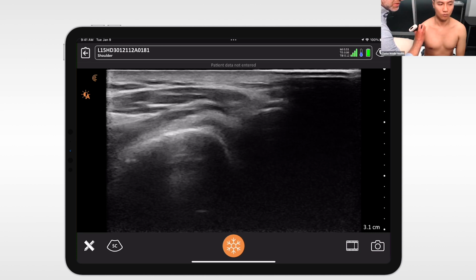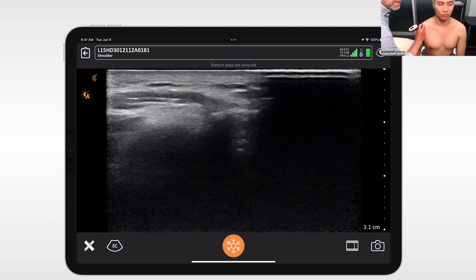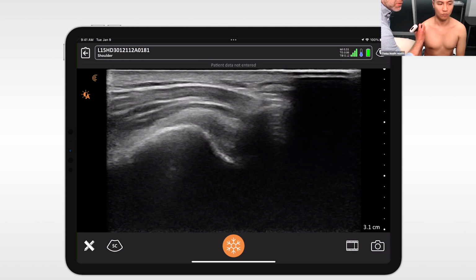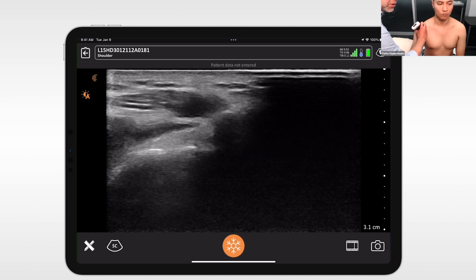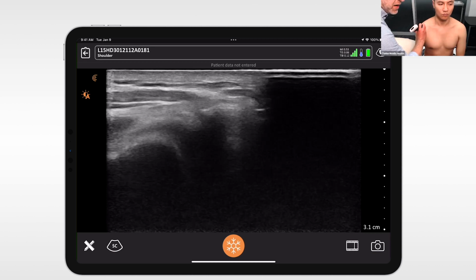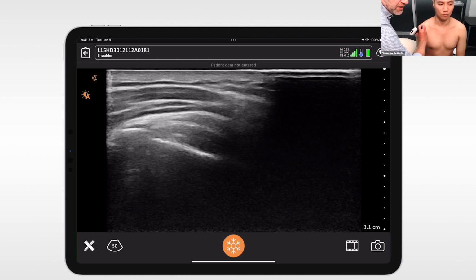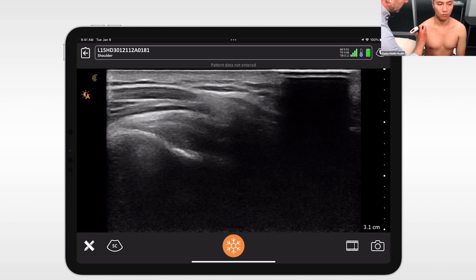Yeah, and a little bit less abduction, so a relaxed starting position, and it really unfolds the supraspinatus, and then from there you can make the abduction. Right, there we go. And so now we do a dynamic, go slow, and watch that humeral head duck underneath. I liked how you identified the structures there, looking for calcification or thickening, and predicting even, oh, that's not going to fit, or that's going to cause a lot of pain going under. Yeah, my positioning here is a little awkward.